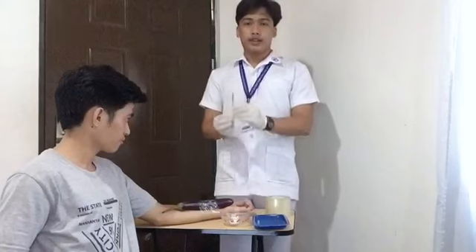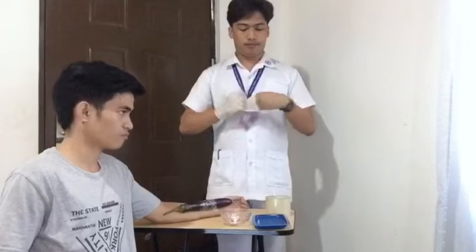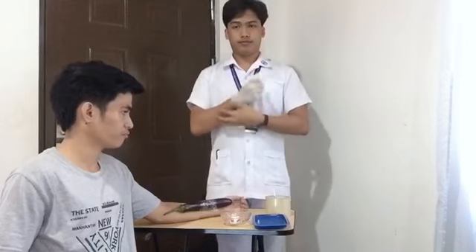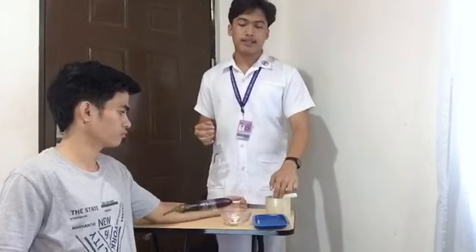So I am going to discard this. Next is do not massage the area because I am going to observe for the skin test. And next is remove gloves and discard the gloves. So I'm going to discard this.